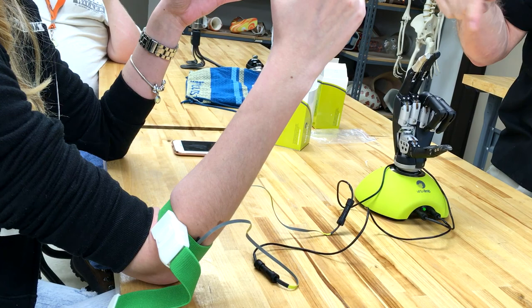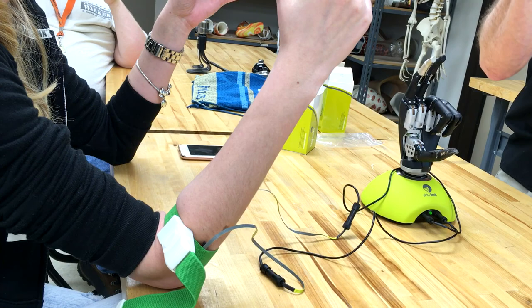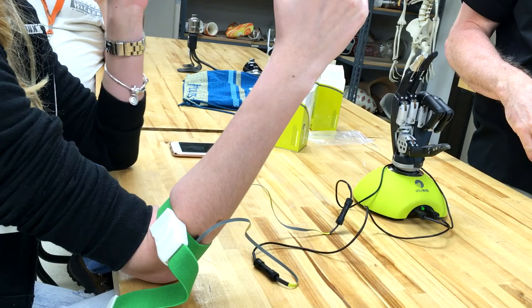When you do the flick, if you do it correctly, you switch the grip pattern, that's one of the switches. So when you do that and you see these fingers move into the new pattern, then do your extension and your flexion again.